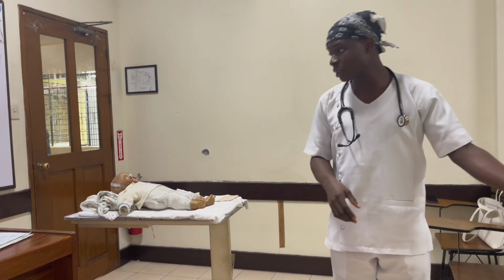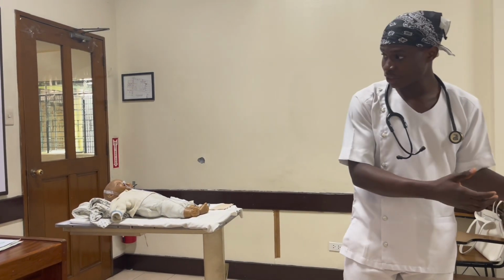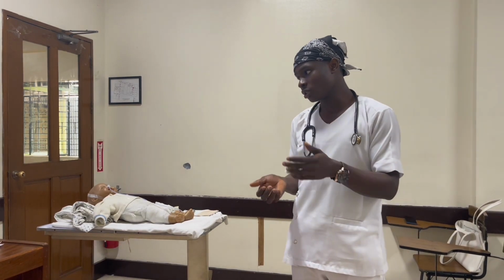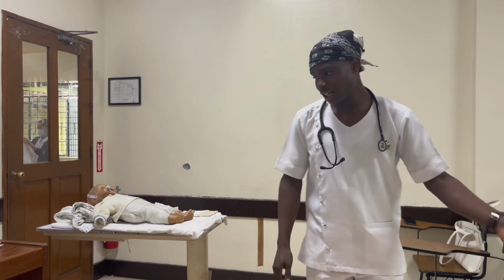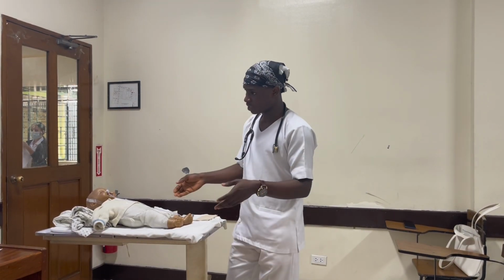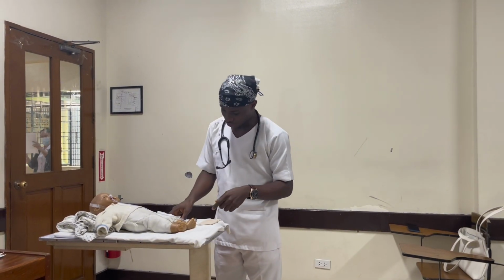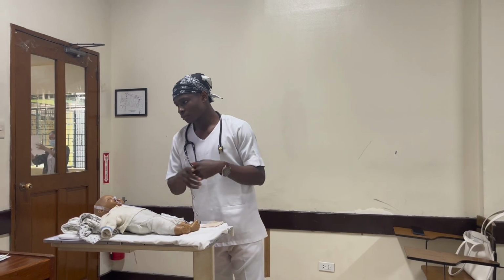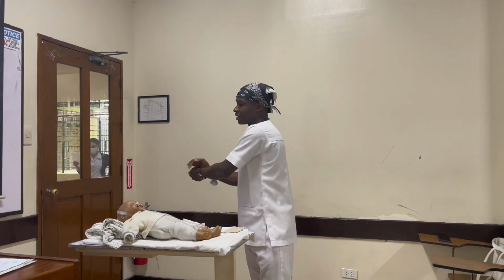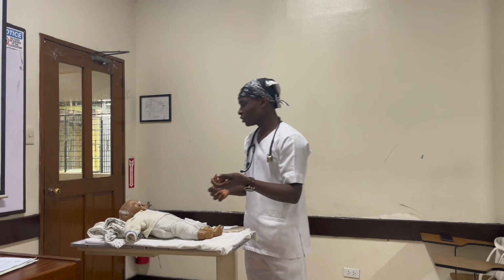I have to check the involvement of the mother with the baby, then ask the mother the name. This is also where I can now get the baby's milk, and make sure that the milk is not hot, not cold, but room temperature. Then after that, what is the next thing to do? I've gathered my equipment: my stethoscope, my syringe, the milk, then the tissue. Then what is the next thing to do? The next thing is hand washing. After that, I dry my hands, then put on my gloves. After which, what is the next thing?